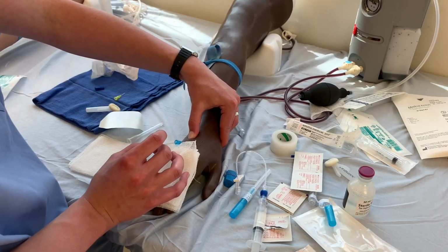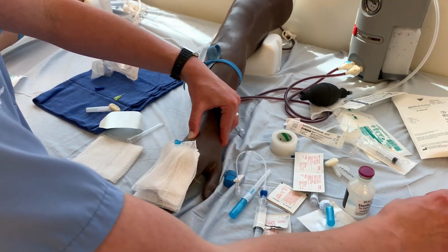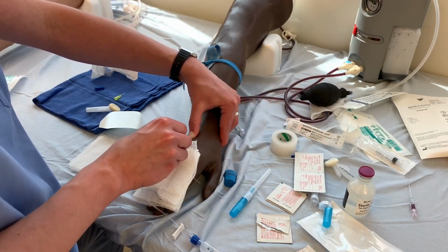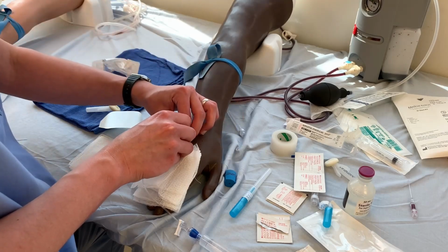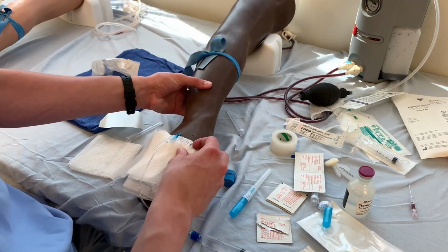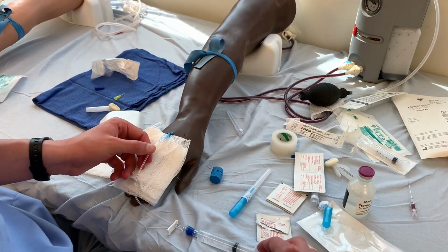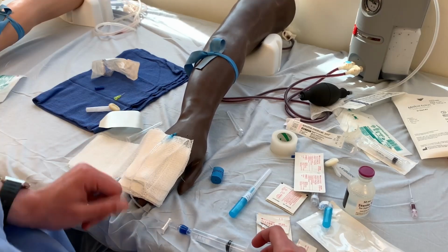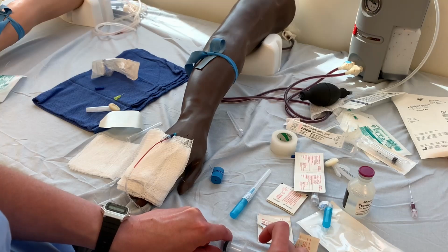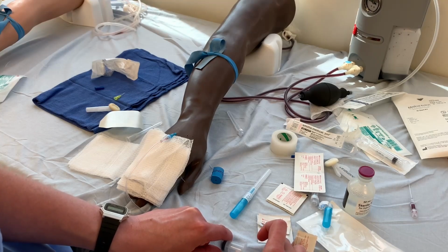Really trying to occlude that vein. Hooking up our saline syringe that has been flushed. Pull back slightly. Oh, just a second. And there you go, venous blood. And then flushing it back in. And so at this point you can go through, secure it, and you have a working IV.